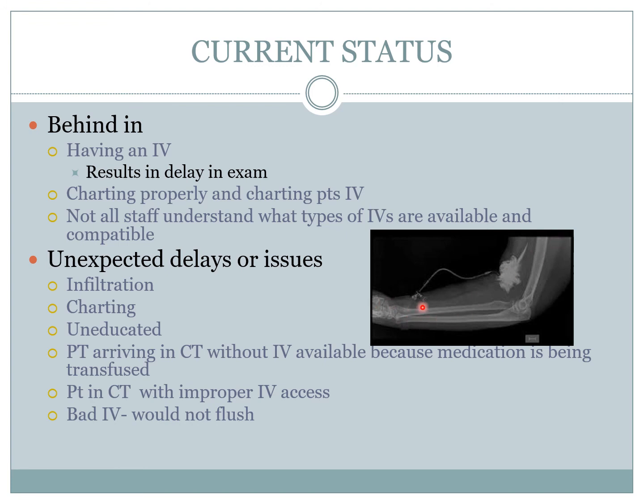So the patient comes with the IV on the same arm. Can we use it or can we not use it? That is the question. And the answer is no. Because if the IV access is right here and the bullet's up here, what if the contrast goes in and there is no blood flow and the bullet actually went through one of the arteries?